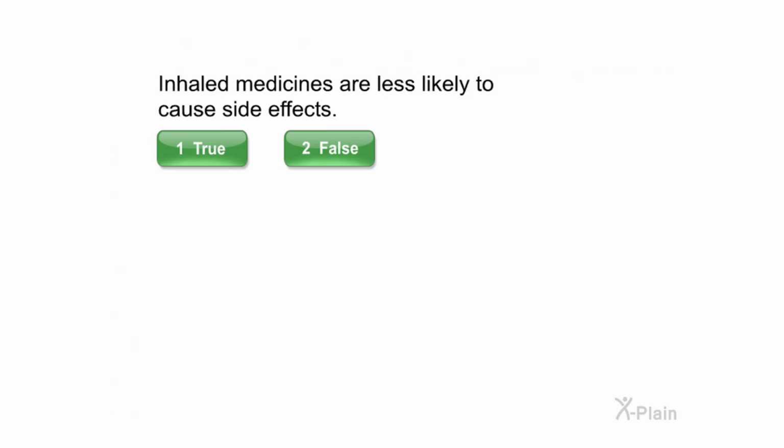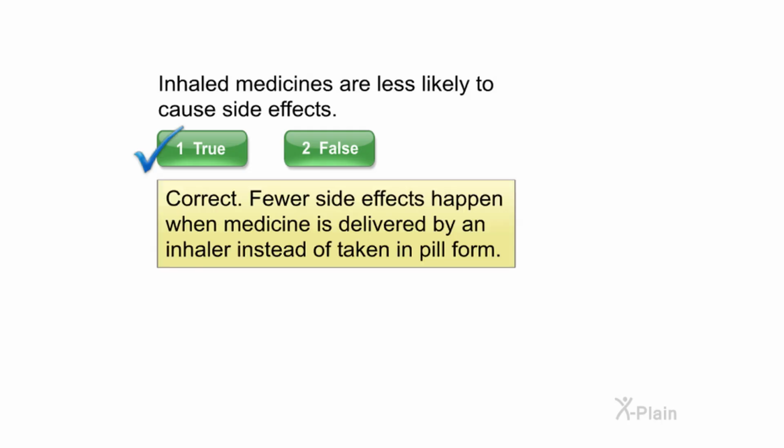Inhaled medicines are less likely to cause side effects. Select true or false. Correct. Fewer side effects happen when medicine is delivered by an inhaler instead of taken in pill form.